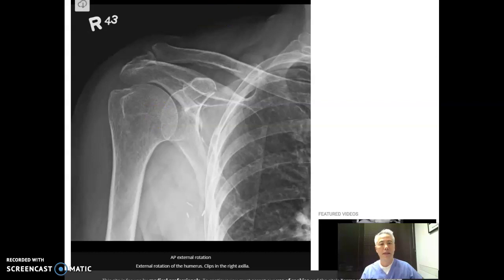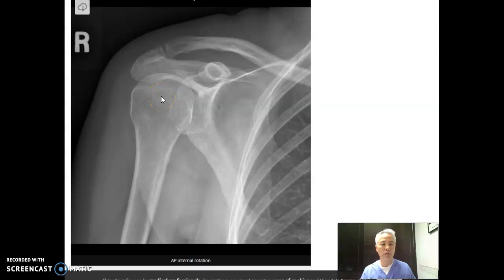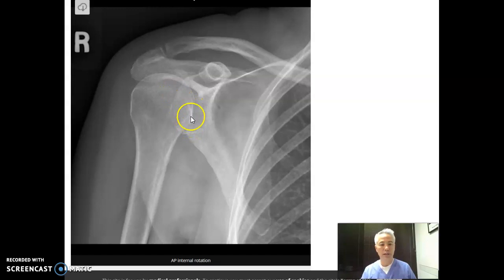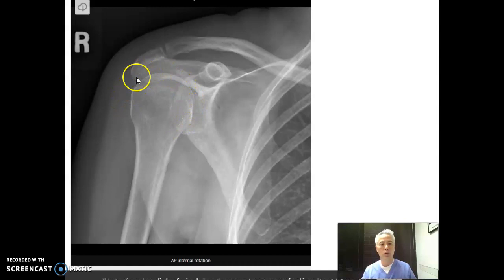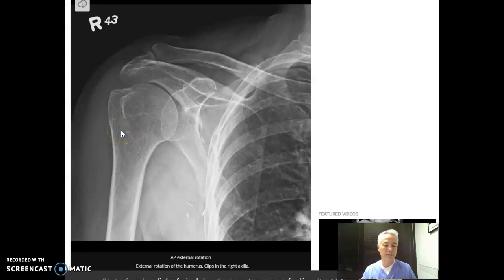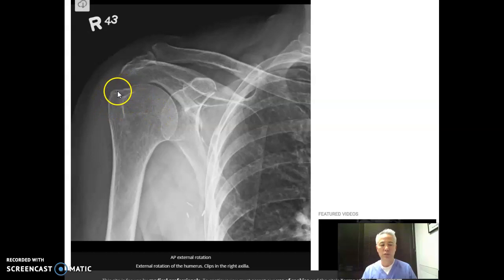Our next one will show an internal rotation. You turn the palm from external rotation towards the body and then turn it out the opposite way so that the palm is actually facing lateral. What that does is move the greater tubercle towards the inside of the bone, but it brings out this point right here, which is your lesser tubercle. You'll see this kind of little edge or point right around the glenoid cavity, and this is indicative of an internally rotated shoulder. This looks more like an ice cream cone — the whole head of the humerus looks like a lateral view, tapered right across. The external rotation has more of a puppy dog appearance: the eye, the little nose or muzzle, and the little ear kind of towards the back. Students tend to remember it when they think of the puppy dog or the ice cream cone.